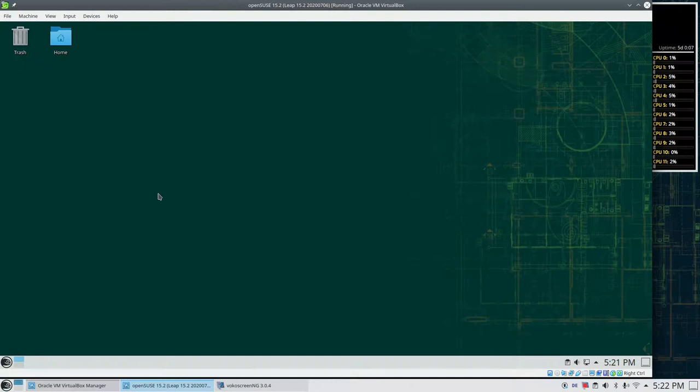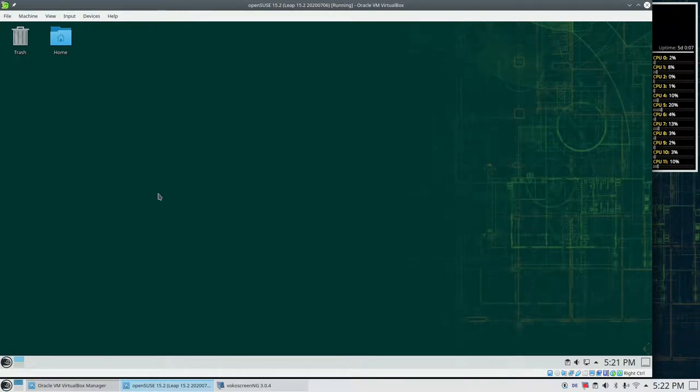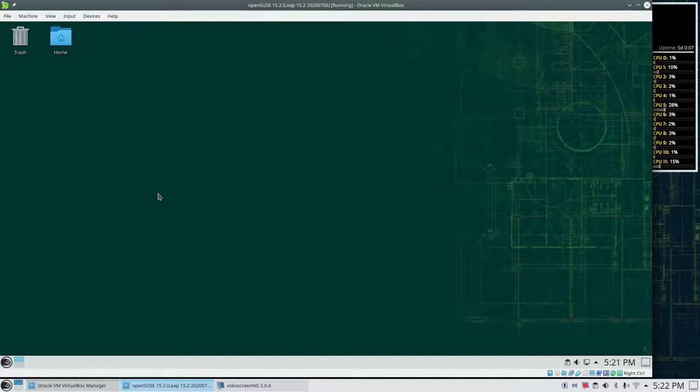Hello everybody and welcome back. In this screencast I would like to show you how you can install Orthanc on OpenSUSE Leap 15.2.